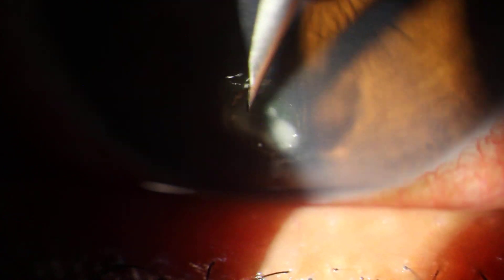This is just like soft rubbing, but you don't really feel it. Good, that's good. And then a little bit on the other side.